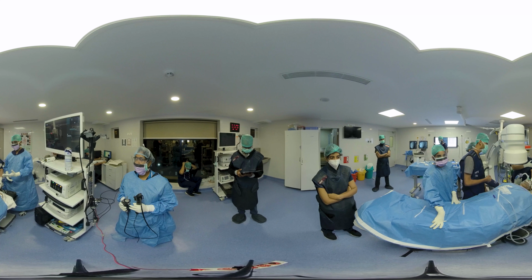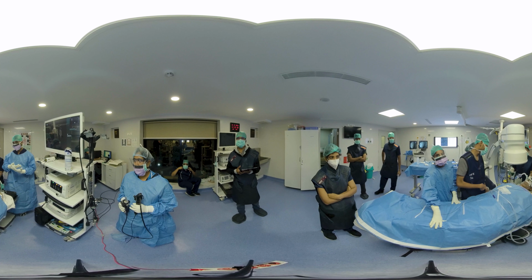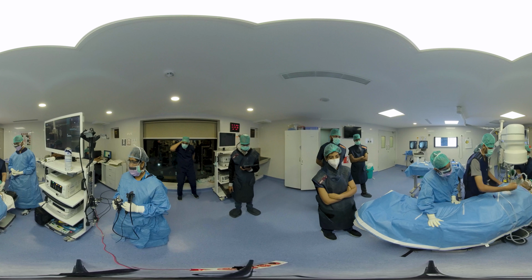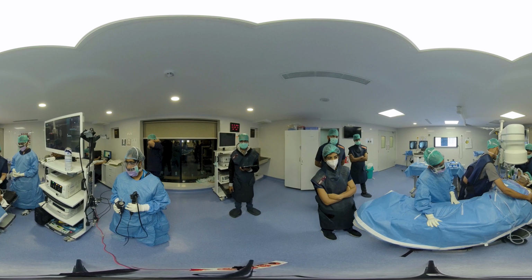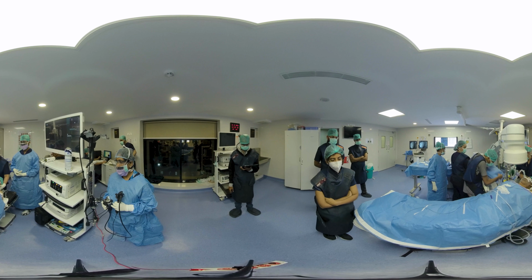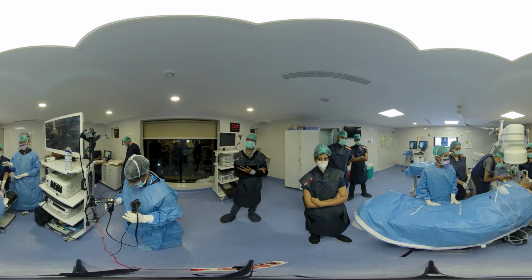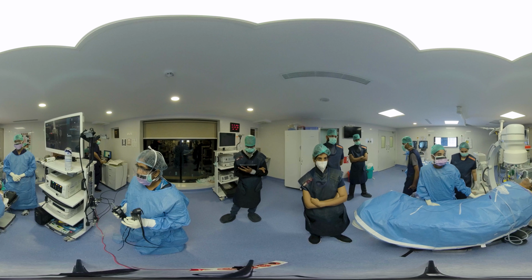So right now we are going to do the rigid bronchoscopic intubation. Now you can see that our anesthetist will be carefully holding the neck of the patient, and we are keeping a shoulder roll to make sure that we get the sniffing dog position. We make sure that the neck is not too much extended. We are ensuring adequate extension of the neck by keeping some padding below the head ring, and now you can see that we have an optimal positioning of the patient.